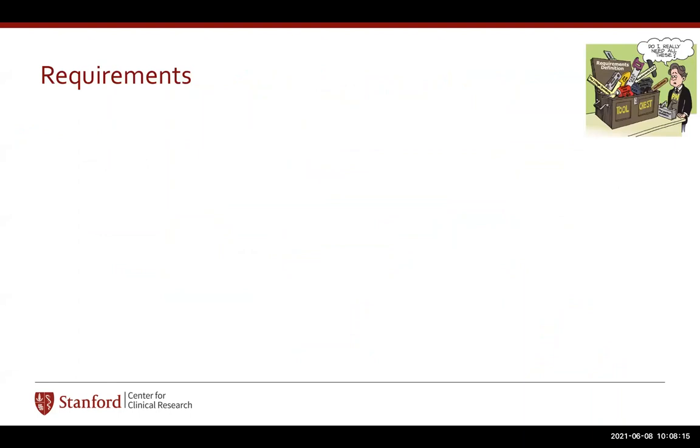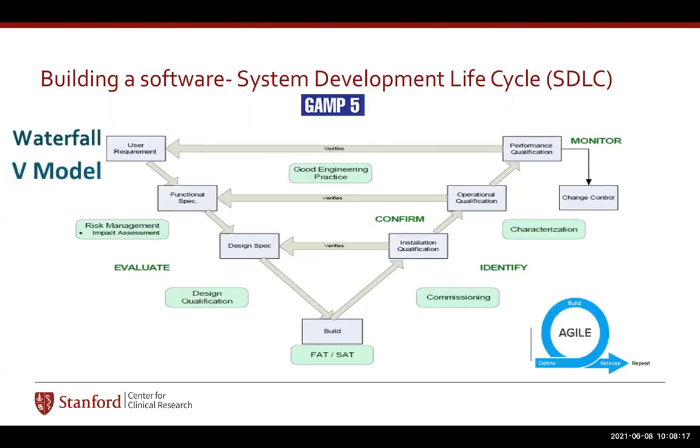Moving to the next slide. I didn't mention the Agile system. Nowadays, because things are so complicated, people are using agile methodology, which means that they will build something which is barely functional. They will release it and then repeat it until they think that it is working. And then they will start creating some of the documents just to really squeeze the development time.